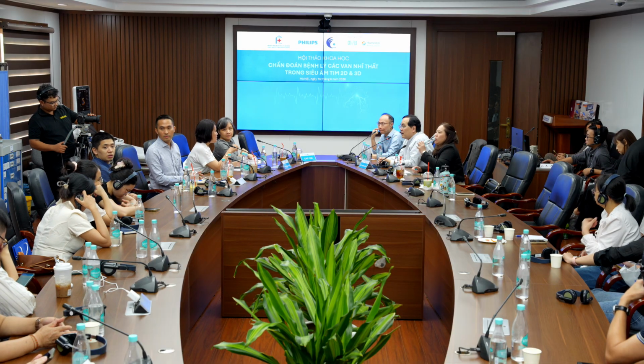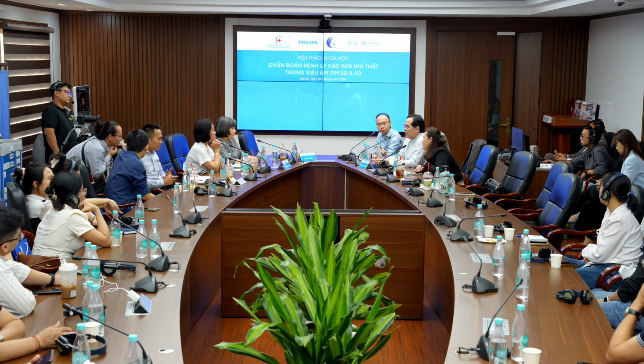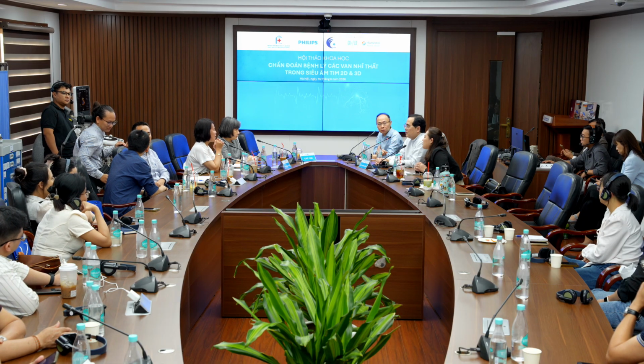So for the ICE, who will place the ICE, the echo doctor or the interventionalist? 2D ICE is actually done mainly by the structural interventionalist. She will be pressing the button to acquire the images. But obviously, when we are less busy, we will always join the structural team, even if we just stand beside the machine and the technician will acquire the images.